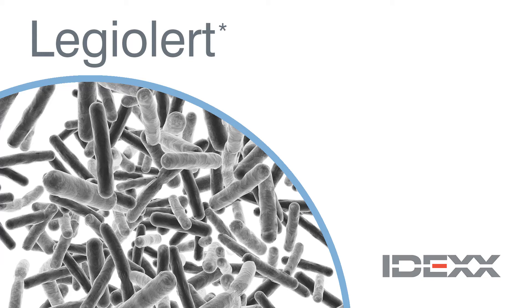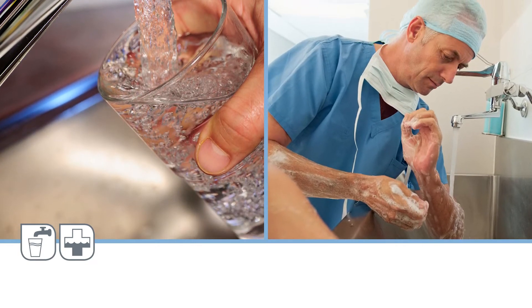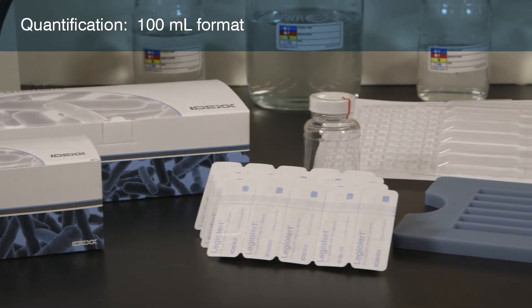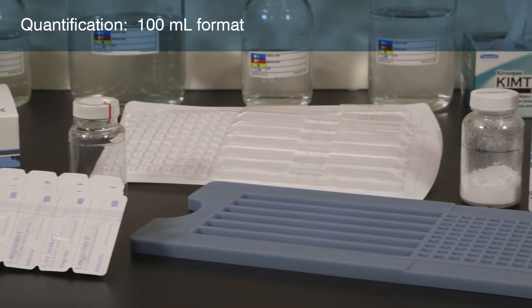The IDEXX LegiAlert test detects Legionella pneumophila in water samples in 7 days with no confirmation steps. LegiAlert is available in a 100 milliliter format and can only be used for quantification.